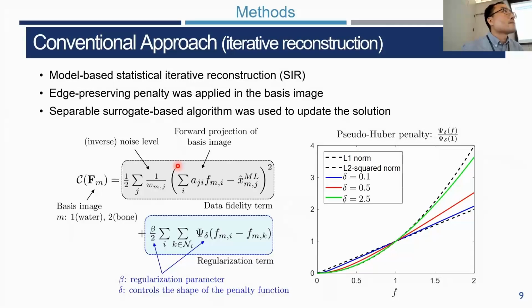You can incorporate a Markov random field prior, and the non-local prior that you have used. You can also play with the norm for the prior, with the deltas, right? How is SIR different from what you have proposed here?